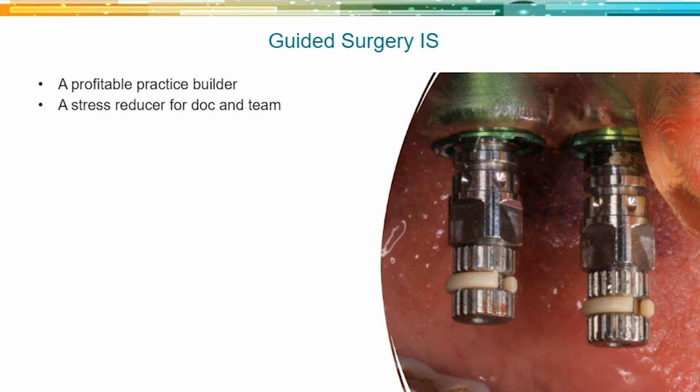Once you get comfortable with whatever guided kit or guided system you prefer to use, it can make things a lot simpler. The kit can streamline some stuff. You've already done the surgery in your head or on a computer before you see the patient. That's usually how I'll position it to the patient. I'm going to do the surgery myself on you digitally several times. I'm going to get it perfect, and then when we finally do the surgery on you, it'll have been the 5th or 10th time that we've even done this, so it'll be a piece of cake.